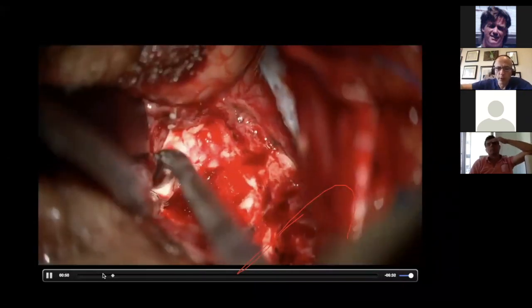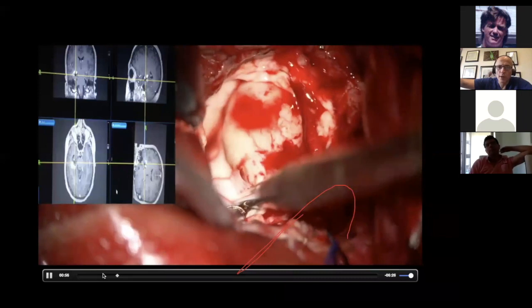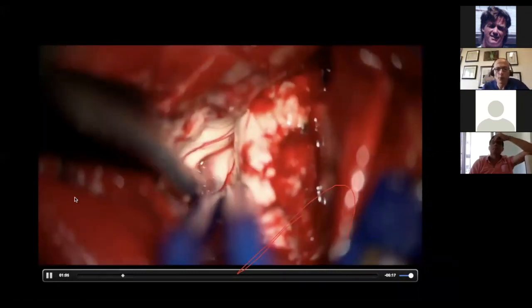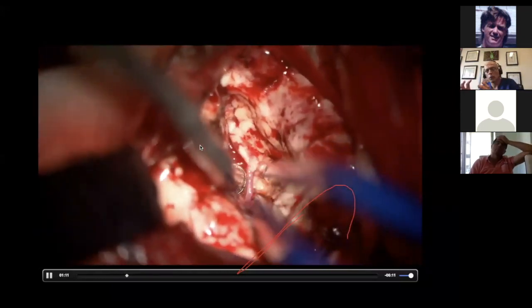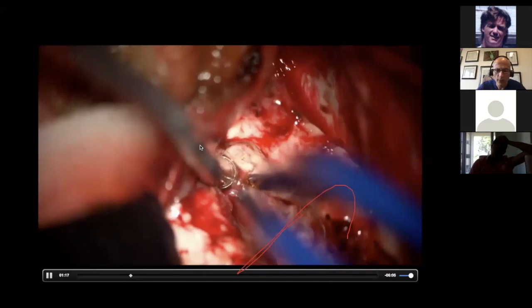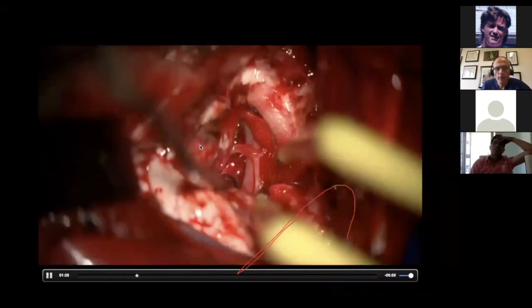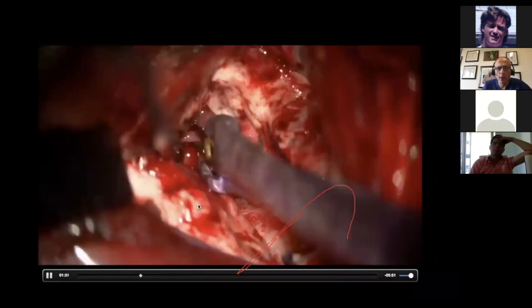I went subtemporal, pretemporal, and then I made the incision between the fusiform gyrus and the parahippocampal gyrus and got into the ventricle. And then once you get into the ventricle, you know the normal anatomy, you have to open the choroidal fissure, which is here. And this is the entire anterior one-third of the hippocampus's AVM. So I'm going to Doppler the hippocampus, it will show that this is completely nidal. See? So that's the hippocampus, that's the AVM within the hippocampus.